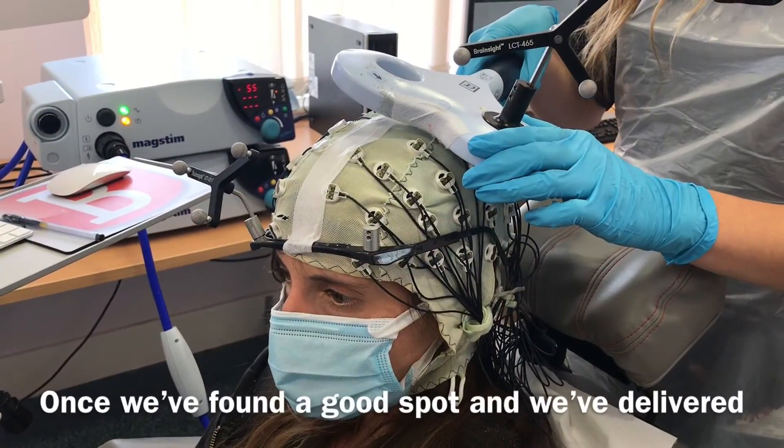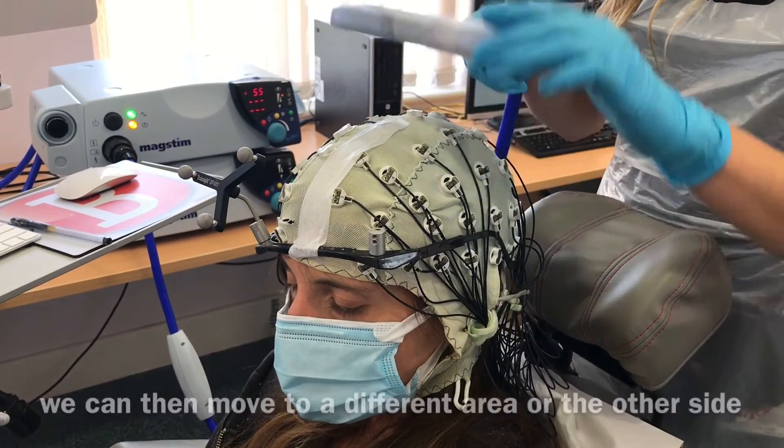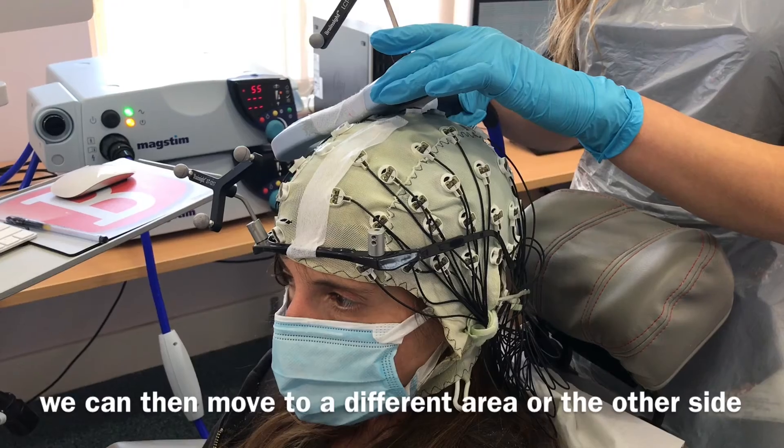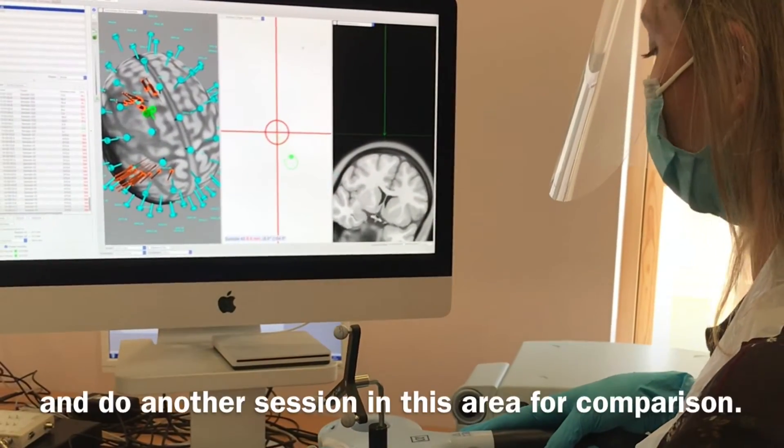Once we've found a good spot and delivered several stimulations in that area, we can then move to a different area or the other side and do another session in that area for comparison.